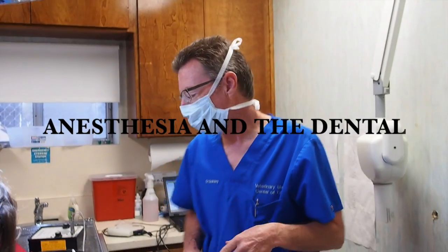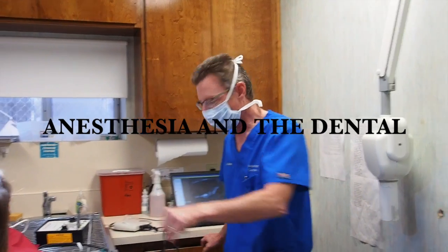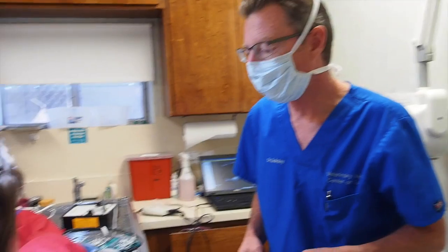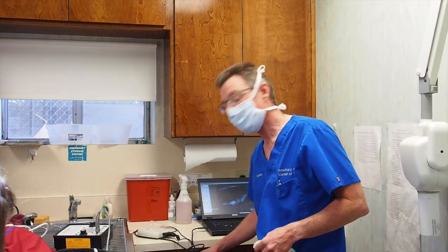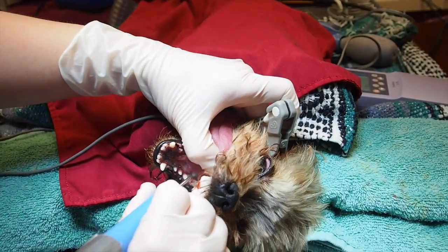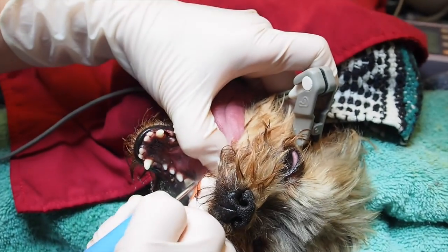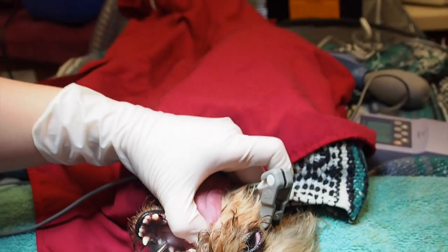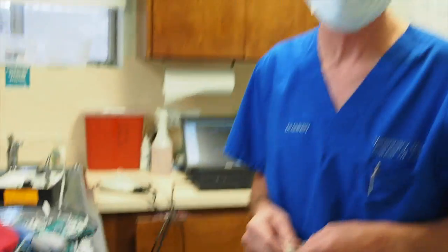Here we are with Jasper, and we started the dental on him, and we do it under anesthesia, and Stacy's actually using the power scaler to clean that tartar off the teeth, or calculus off the teeth. Maybe if you want to get a close-up of that. And so the tartar on the crown of the tooth is actually the least important part of the dental for the pet. It's the only part that the owner can see, but it's the least important for the pet.